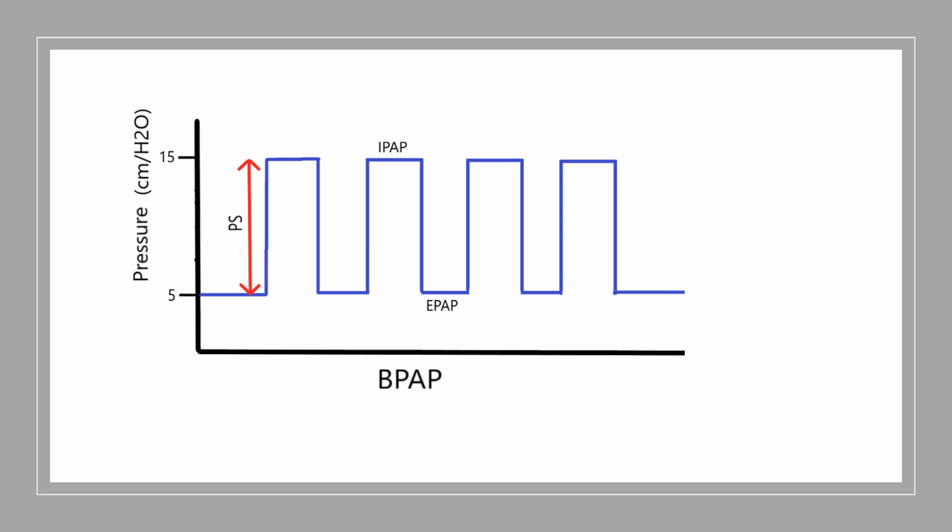This is a truly beneficial therapy in any patient with work of breathing for the most part, and certainly for your bronchospastic diseases, especially COPD. But I've had huge successes with it in virtually all cases, whether we're talking about cardiogenic or non-cardiogenic pulmonary edema, your aspiration patients, your pneumonia patients, your COPD patients, even other types of acute respiratory distress. It's very, very helpful, and it's very simple to use.